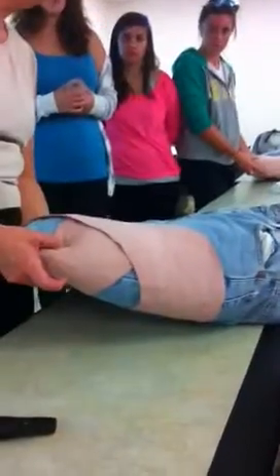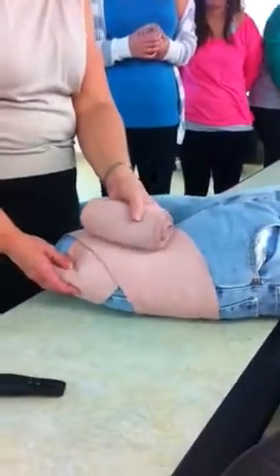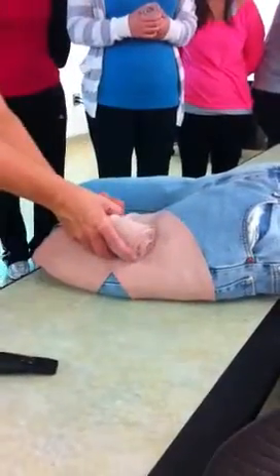There are a couple of things I need to be cautious with, or really thoughtful about, when I'm doing this kind of wrap. I need to get the person to, I can say the word, abduct their leg so that I can get way up in the groin area. Okay, I want to be up as high as I can go.